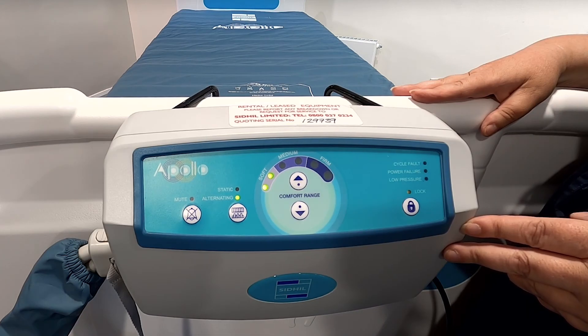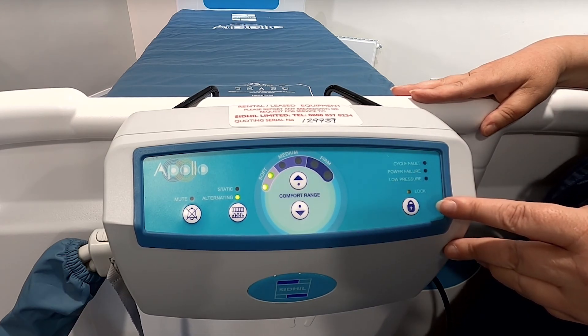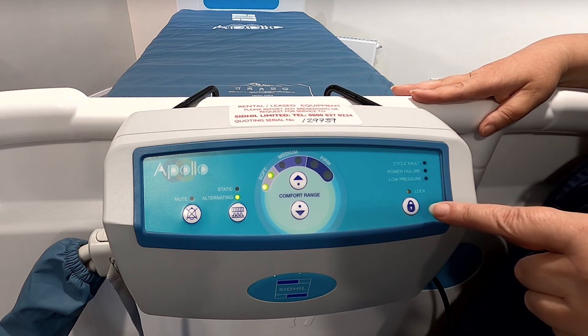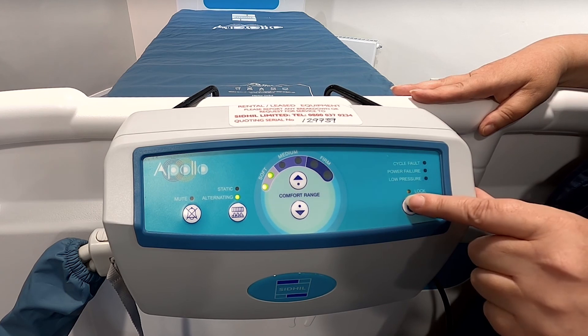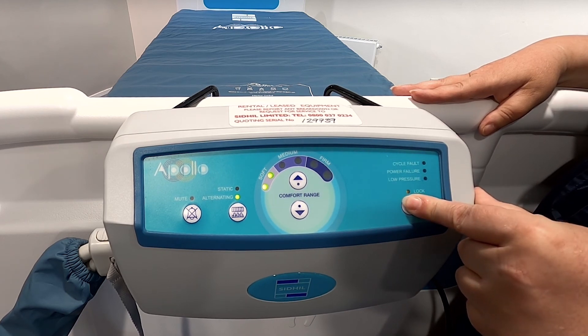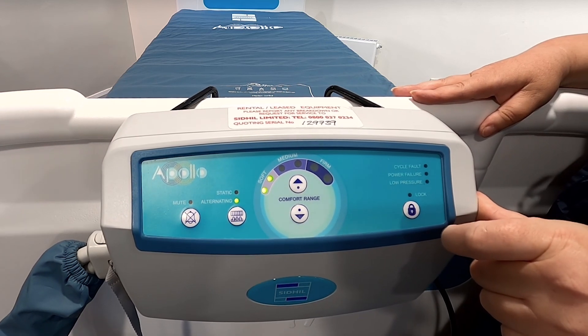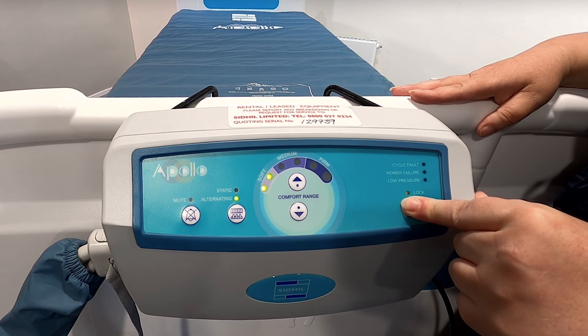The third function we're going to look at is the lock system. The control unit will automatically lock out all functionality after two minutes of inactivity. When the system is locked, an amber light will illuminate, as you can see here. To unlock the control unit, press the button for two seconds. To re-engage the lock, again press for two seconds and the automatic lock will re-engage.